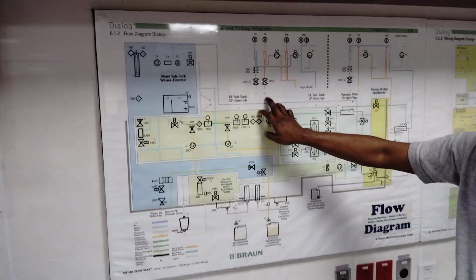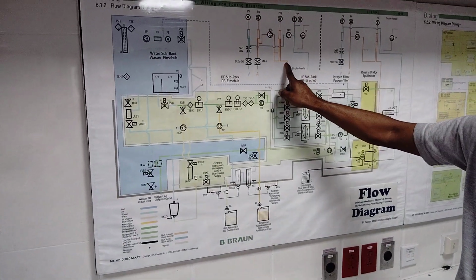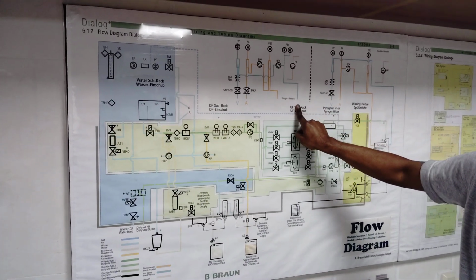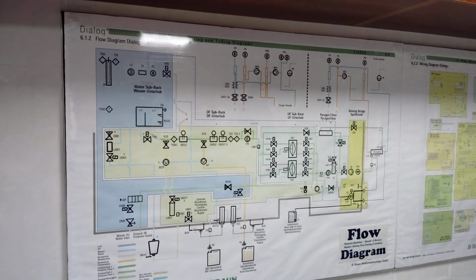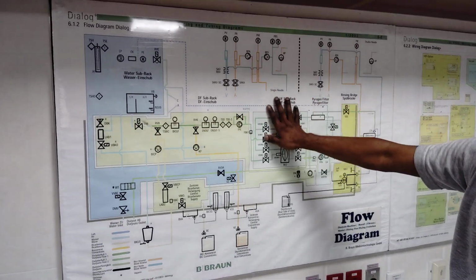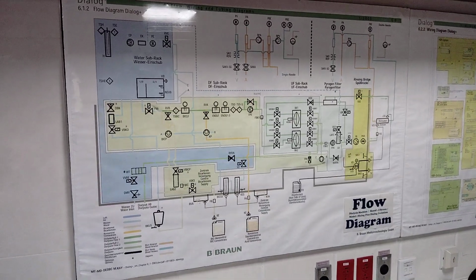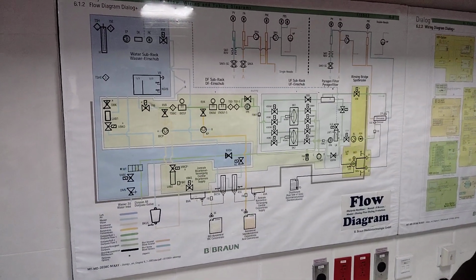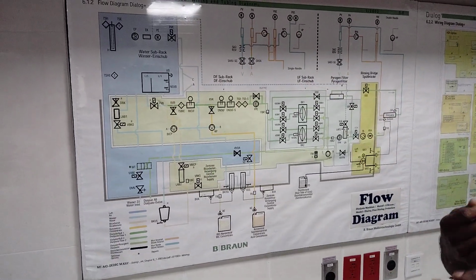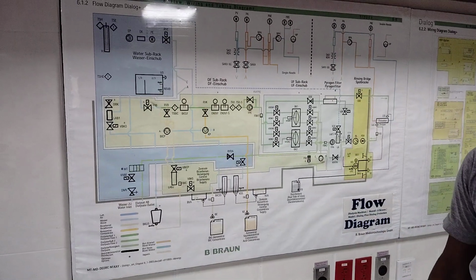And this is the patient, suppose. It will take the blood from here, pulling and pushing it through the pump, again back to the patient. One in, one out. In between there is a blood pump, which we will show you on the machine later. Blood pumps are there, heparin pumps are there, two blood pumps are there. If there is single needle, as they call it, we are not using that procedure here. For single needle purposes, they will use a double pump. They will connect only one needle, pulling from that one and sending through the same. That is called single needle.